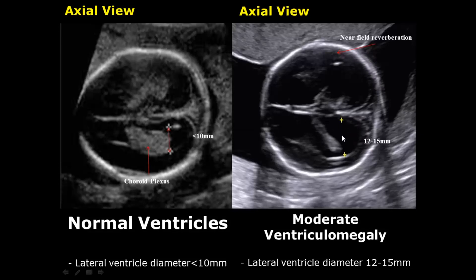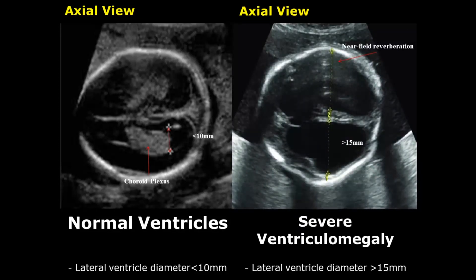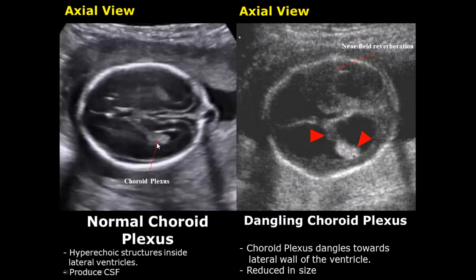As you can see, moderate ventriculomegaly appears larger compared to mild. In severe ventriculomegaly, the diameter of the lateral ventricles exceeds 15 millimeters. The choroid plexus are hyperechoic structures inside the lateral ventricles that produce cerebrospinal fluid and normally occupy most of the space inside the ventricles. In severe ventriculomegaly, a condition known as dangling choroid plexus occurs.